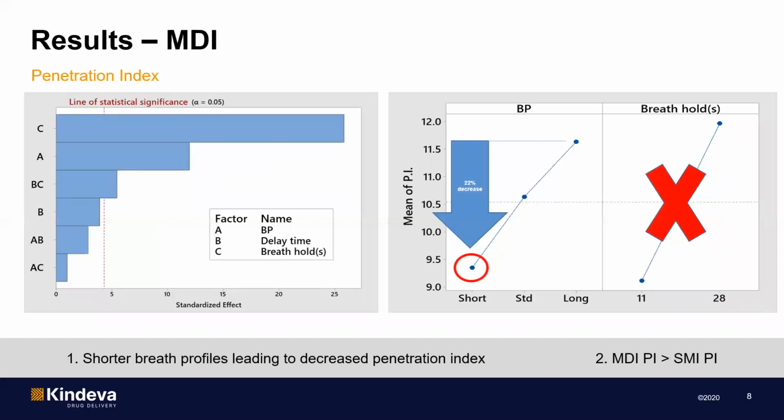We've highlighted instead the case of the variability within the breath profiles, which again could have an impact on the uptake of the drug, depending on the drug and potentially the PK profile. Again, a long breath profile is preferable with its reduced peak inhalation flow. This will reduce deposition within the upper regions of the lung, and it will also increase the residence time for diffusion deposition and reduce the exhaled fraction.